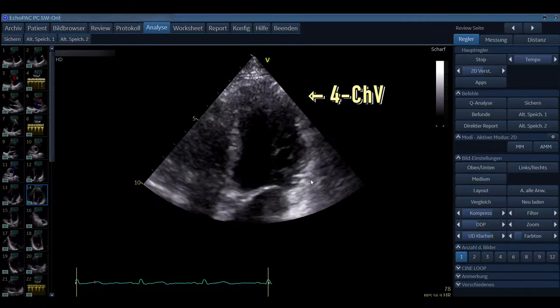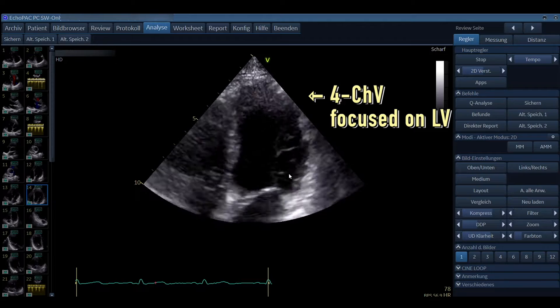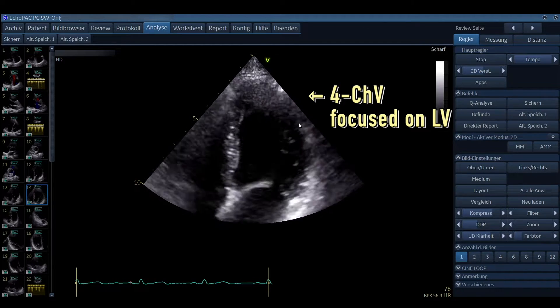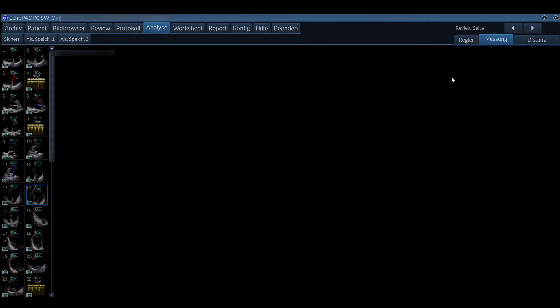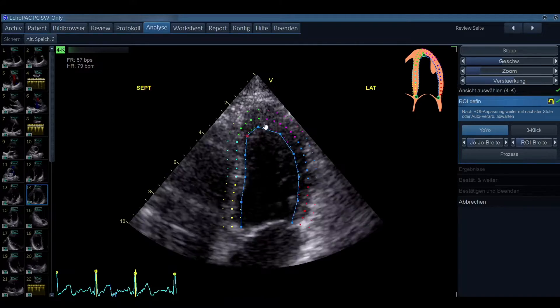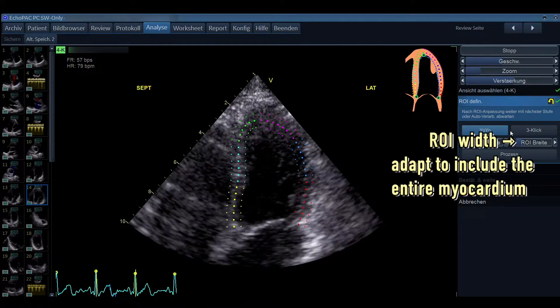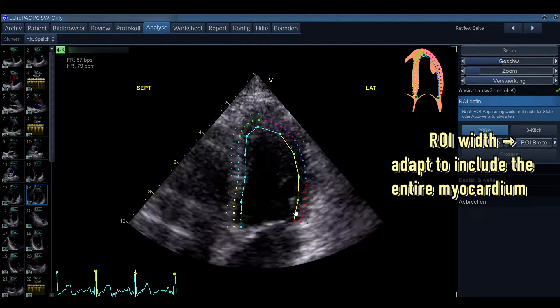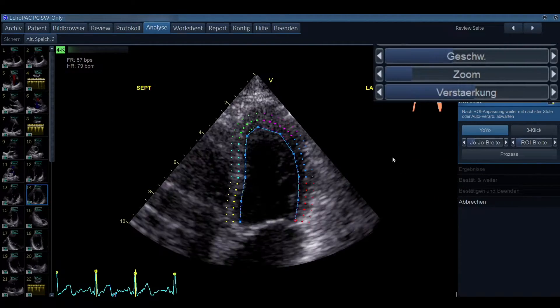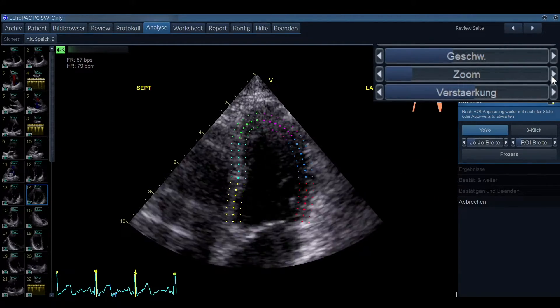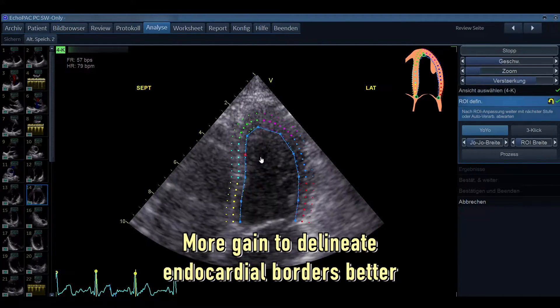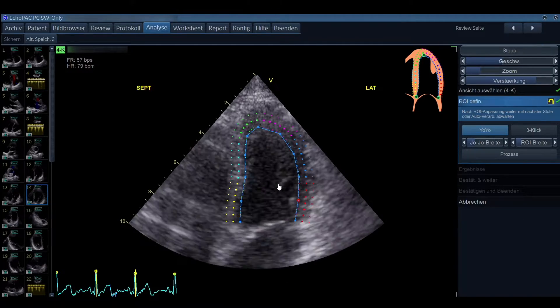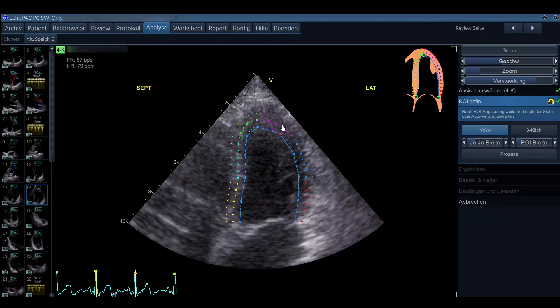Let's see another example. Again we have a four chamber view focused on the left ventricle — the endocardial borders can be delineated quite nicely, but we can still adjust a little. We apply the automatic imaging and it places the region of interest on our field of view. We can then adjust the ROI width to be optimal, and also turn up the gain a little to delineate the endocardial borders even better.